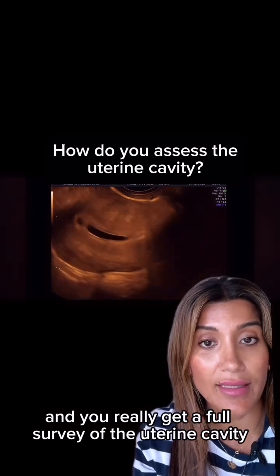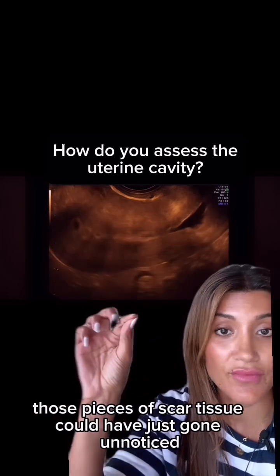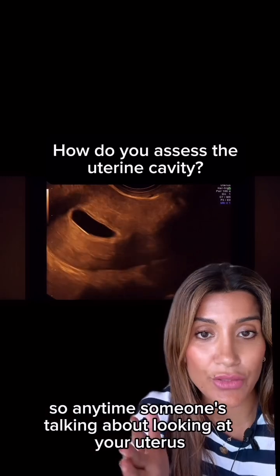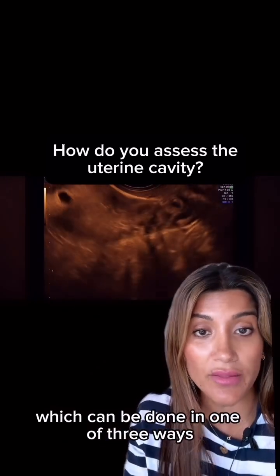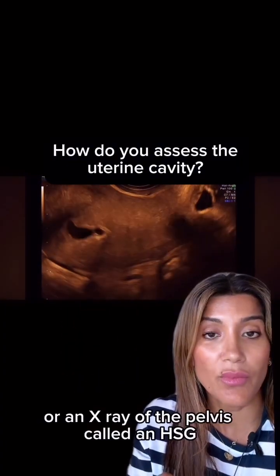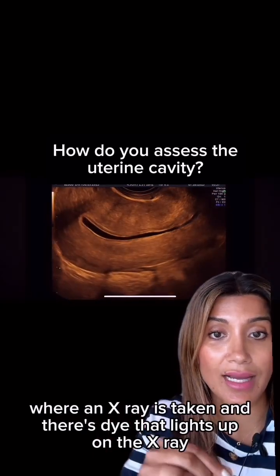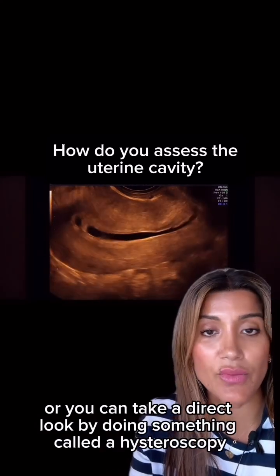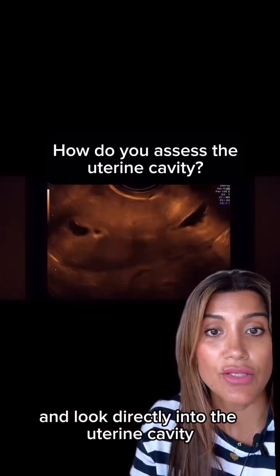Now, had we not done this saline sonogram, those adhesions, those pieces of scar tissue could have just gone unnoticed. So anytime someone's talking about looking at your uterus, make sure there is a specific assessment of the uterine cavity, which can be done in one of three ways. Either a saline sonogram, just like this, with fluid, or an x-ray of the pelvis called an HSG or hysterosalpingogram, where an x-ray is taken and there's dye that lights up on the x-ray that you can see fill the uterine cavity. Or you can take a direct look by doing something called a hysteroscopy, where we put a camera through the cervix and look directly into the uterine cavity.